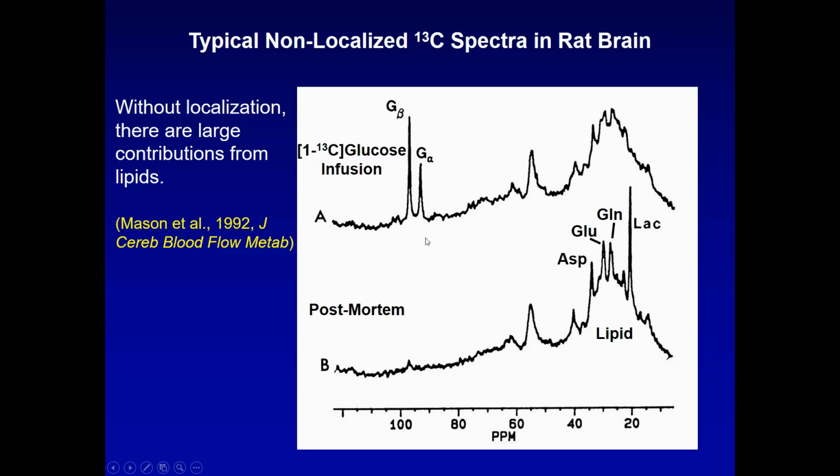And note how it's not so hard to quantify this glucose peak, because we could just draw a baseline here and measure these peaks. But it's difficult here to know exactly where the lipid stops and the small molecules that interest us begin. Localization would be very beneficial.